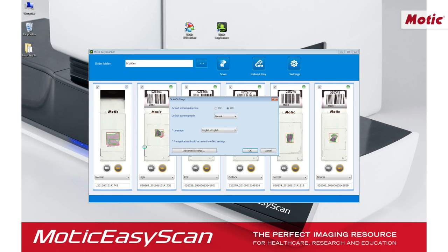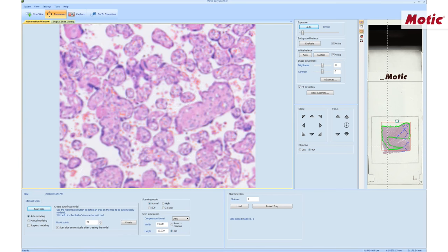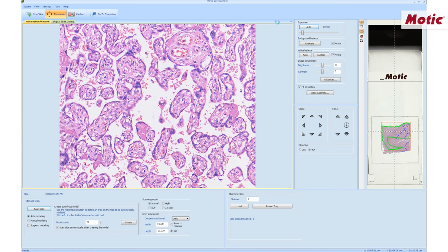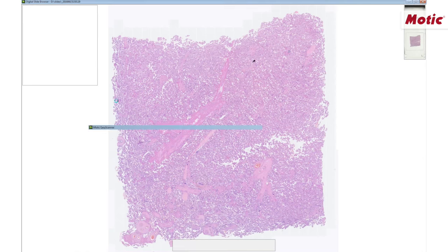On the settings window, the advanced settings are available through a password control. Here we can change the calibration in order to customize the different parameters of the system, like the exposure, white balance, background, etc. Once the scanning process is completed, we can have a first access to the digital image directly on this software, using the image browser included in the software.